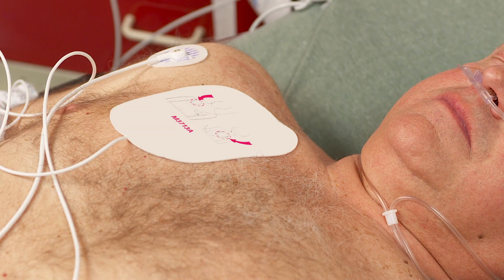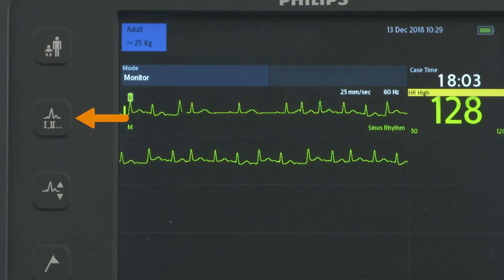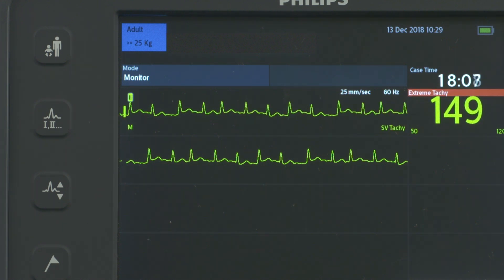In this case, we'll assume we have prepared for both monitoring and synchronized cardioversion using the multifunction electrode pads and three lead monitoring electrodes, and have used the Lead Select button to select an ECG source with a clear signal and large QRS complex.